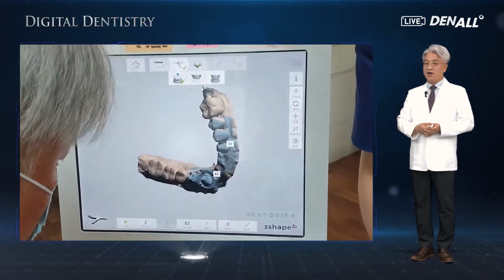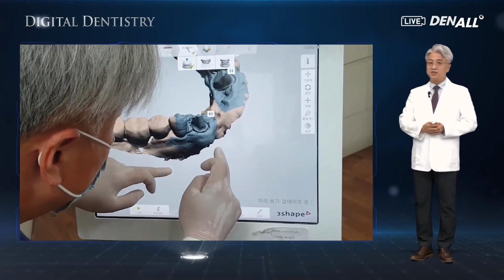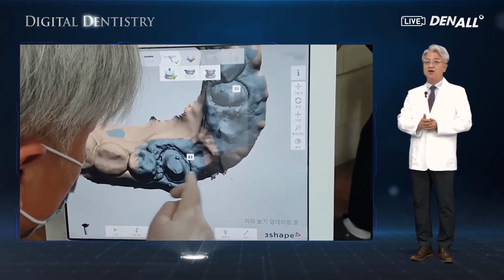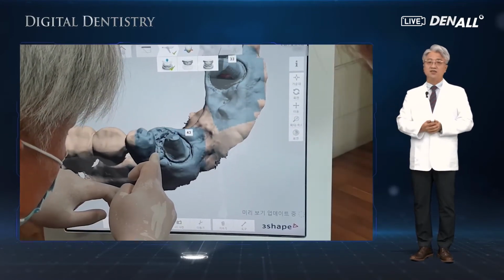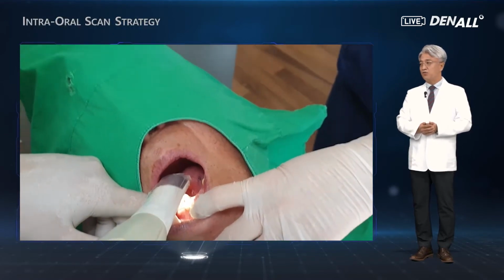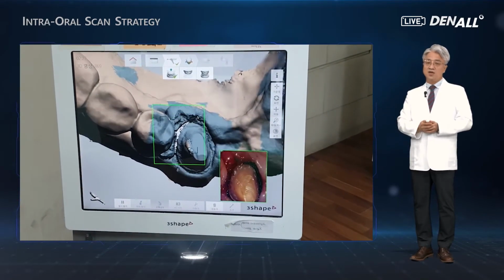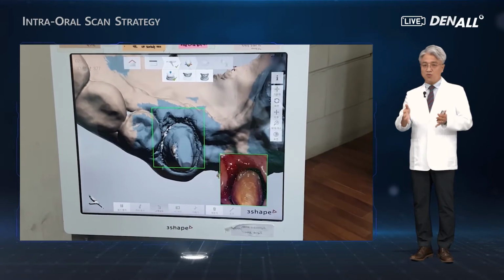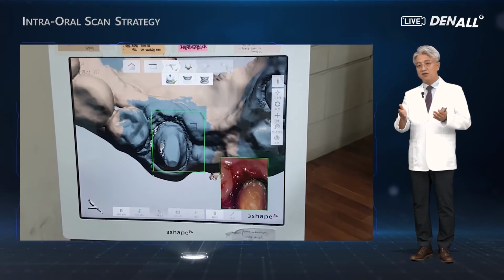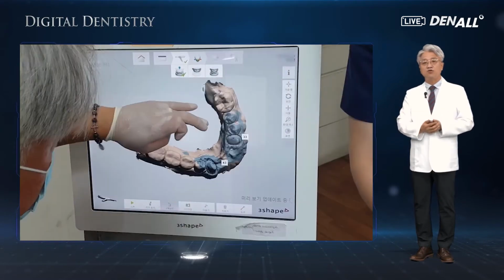And after cord packing, for rubber impression taking, in most cases, the second cord is removed from the double cords. In the empty space, rubber impression material is pushed in and the impression is taken. I scanned like that for years in the past, but as you saw in the previous video, I don't remove the second cord of the double cord, and I pack it a bit more to scan the margin area, sulcus area, by blocking blood from coming out these days.